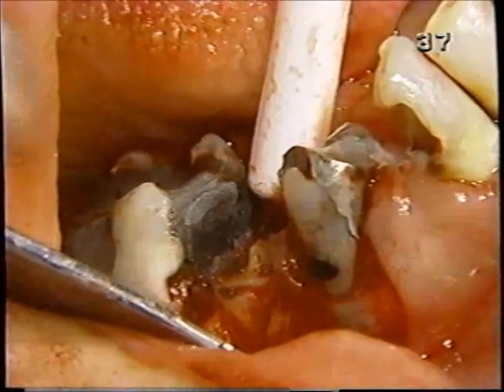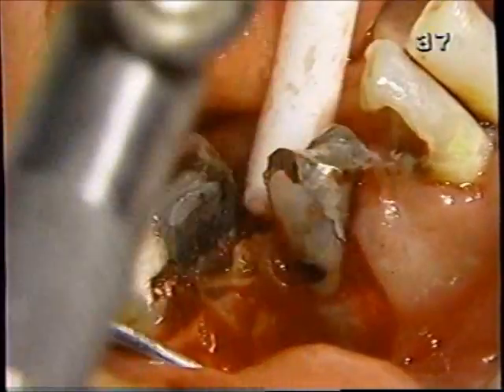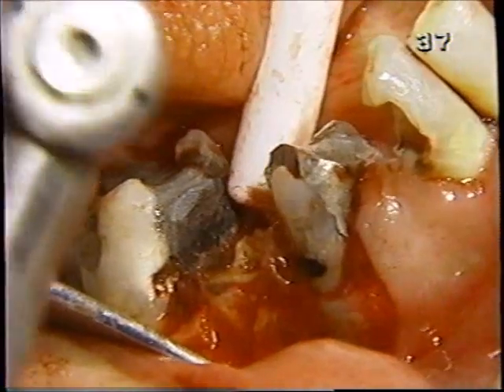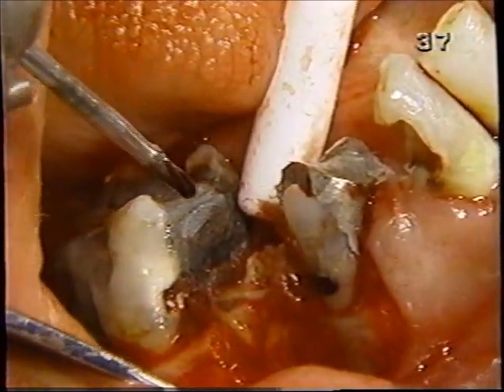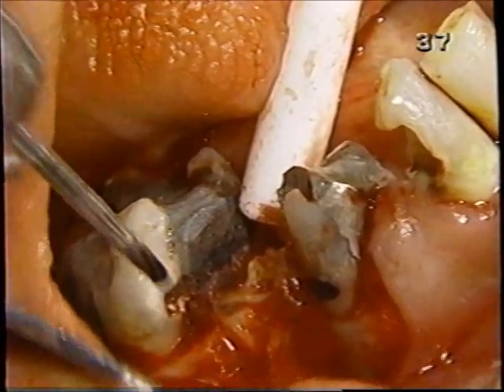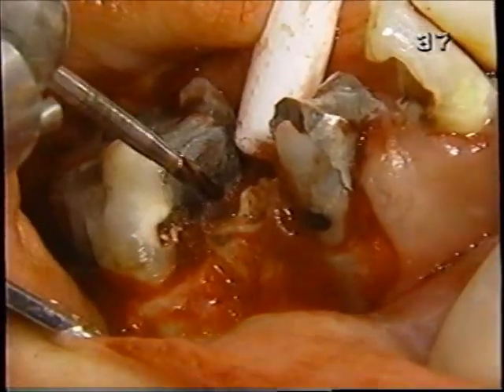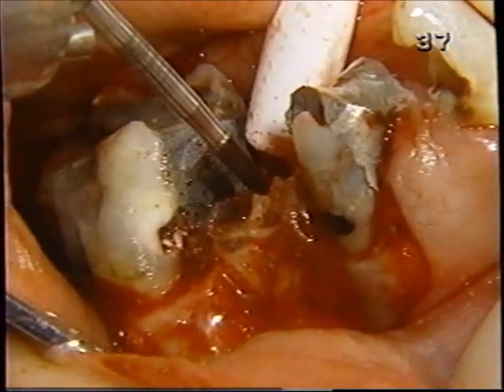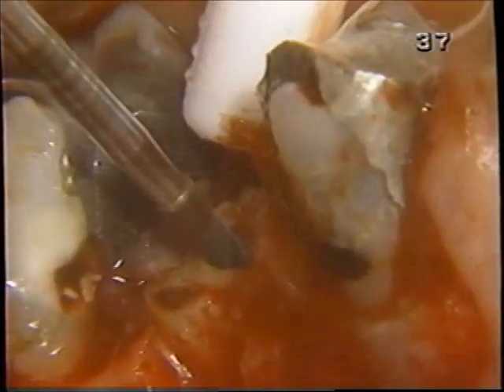Now, the tooth isn't rock solid. There is some movement. It's just that because of the way it fractured on the lingual, the forceps beak keeps slipping off. Even though we could engage well on the buccal, the lingual won't allow us to do that. And we don't want to continue down to the apex. We could, and that would get it out certainly. But we're going to try something else. We've extended the burr out of the handpiece, out of the head, another couple millimeters. And we're just going to go across this tooth, quite deep.